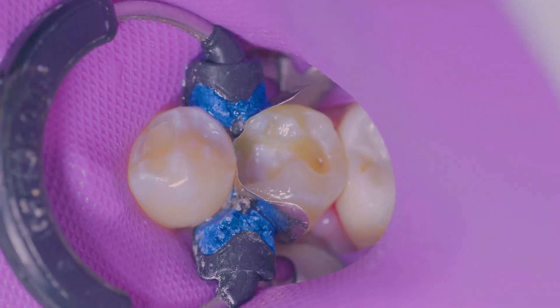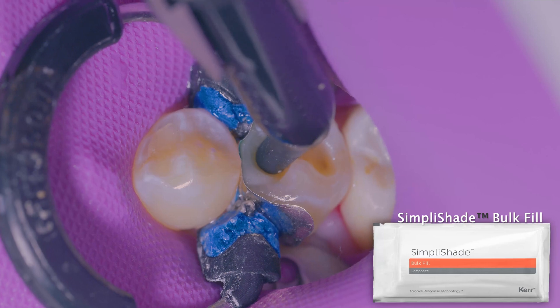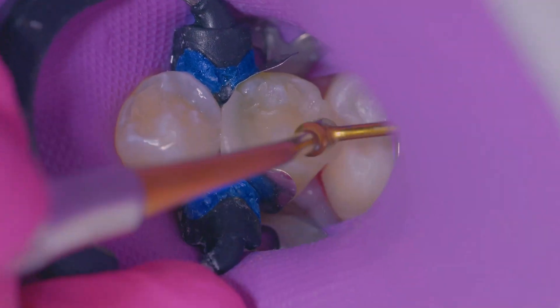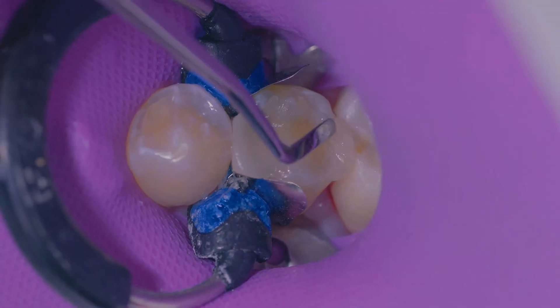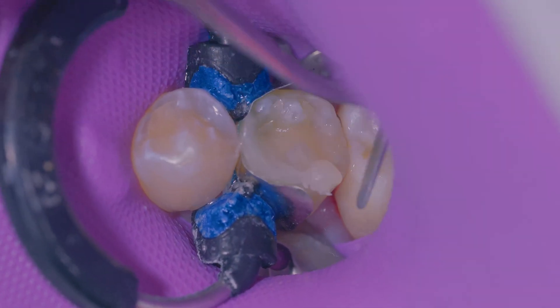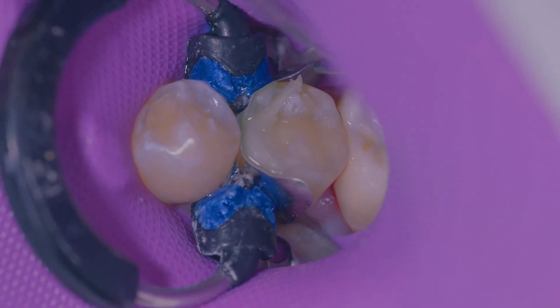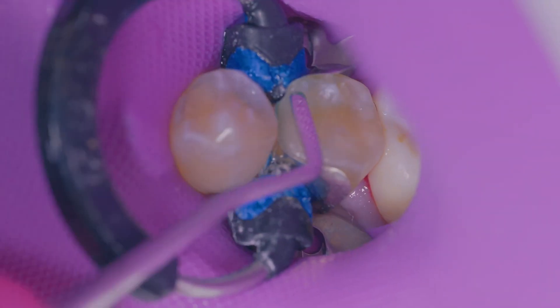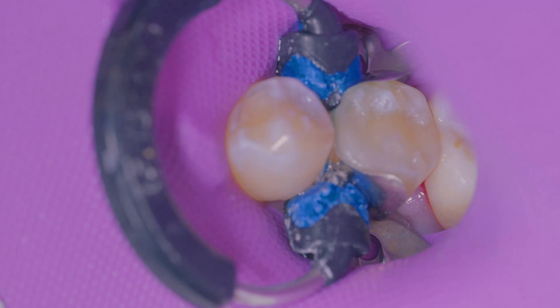Next you can see me placing the Simply Shade bulk fill material. This is a one-shade bulk fill material and you can use it all the way up to 5 millimeters. In this case I just need one layer of it — there's no capping material required. You'll notice right off the bat how easily this material is manipulated. There's no dragging, slumping — it's not sticking to the instrument.